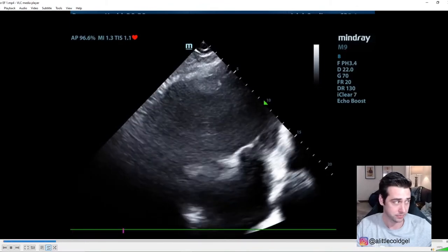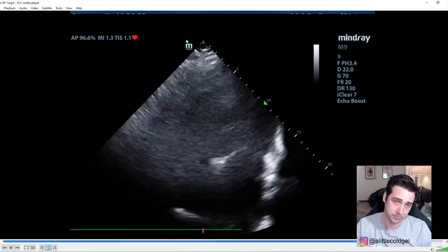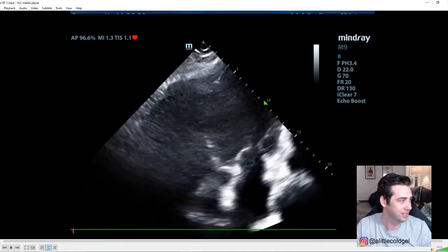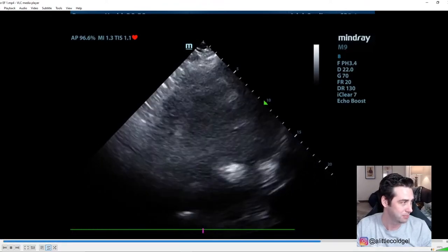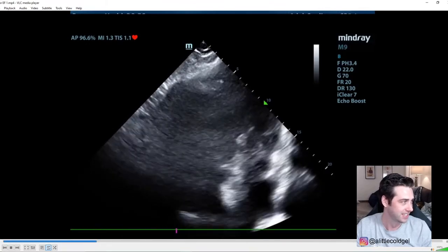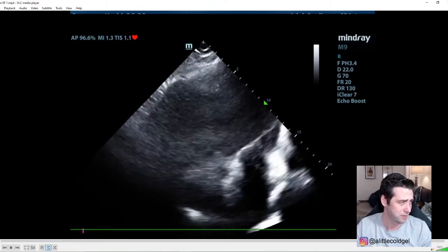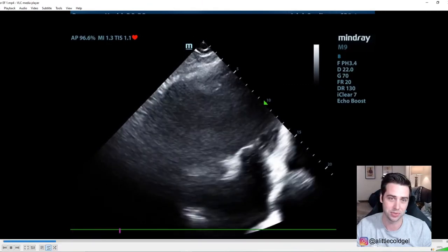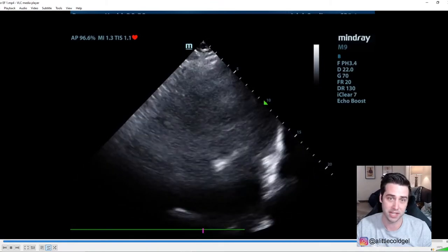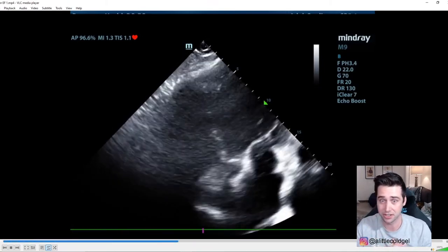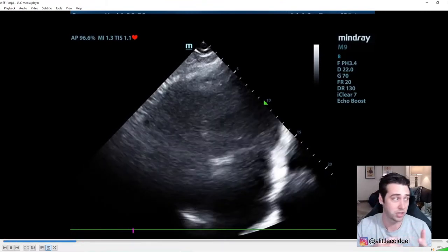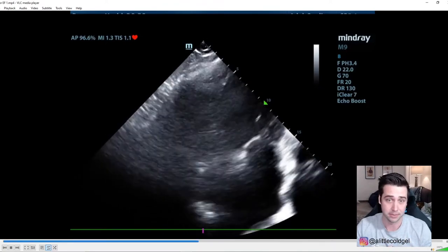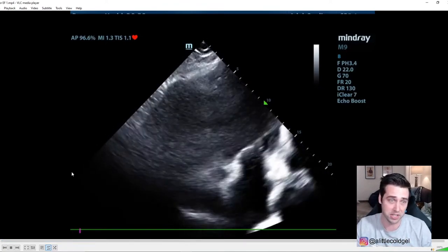Moving on to a cardiac exam. In the ED, the most important things you can really scan are cardiac and lungs — see how the heart's pumping, look for any pathologic finding on the lungs. The M marker up here is branding and important — it tells you which way the probe indicator is pointed. Generally when doing an ultrasound, the indicator is either towards the patient's head or towards the patient's right.